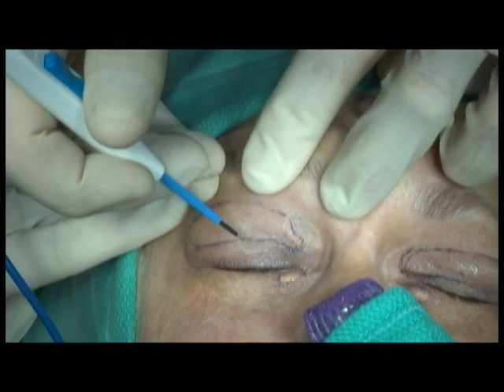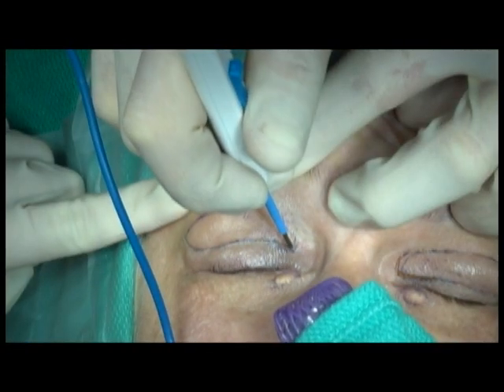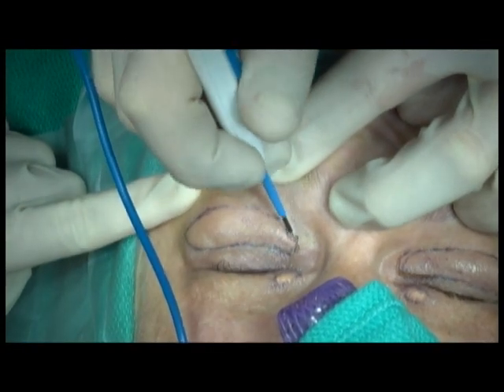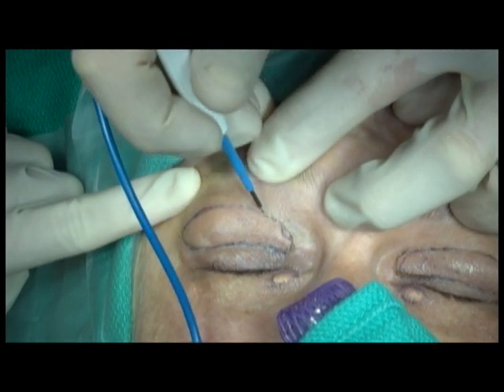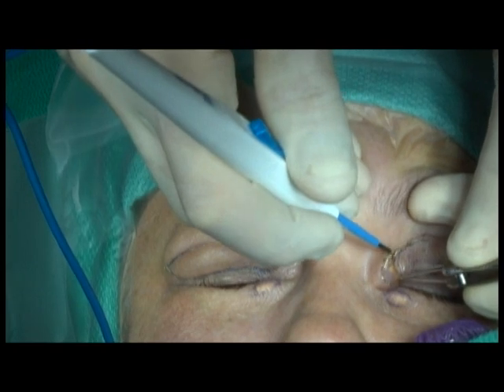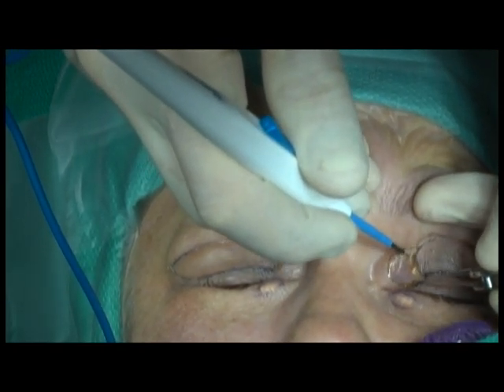An incision is made along the blepharoplasty markings to incorporate the upper eyelid xanthelasma. This results in excision of a fair amount of skin medially. The incision is made with the needlepoint cautery. Dissection is then carried out below the layer of the xanthelasma medially.